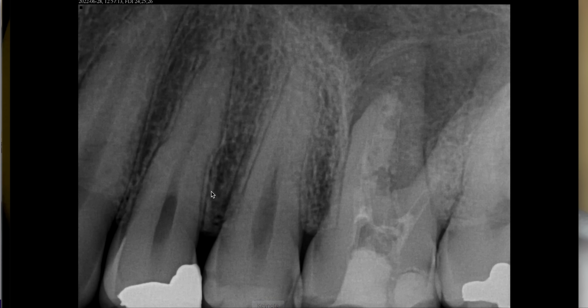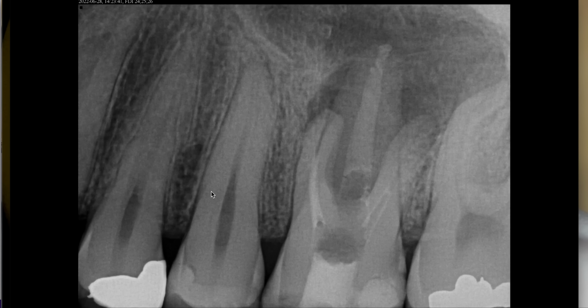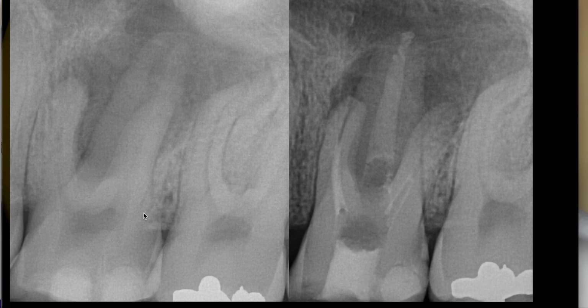Anyways, hopefully it's insightful. Let's go over the final periapical radiograph. So here it is. Now we've got calcium hydroxide back down. We've got, I'm not impressed with this, calcium hydroxide in our mesiobuccal and distobuccal canals, and it's radiolucent here because of the lack of any type of radiopacifiers in the powdered calcium hydroxide. So here is the start a month ago, and here's where we are today.